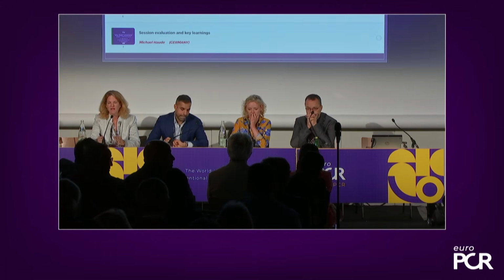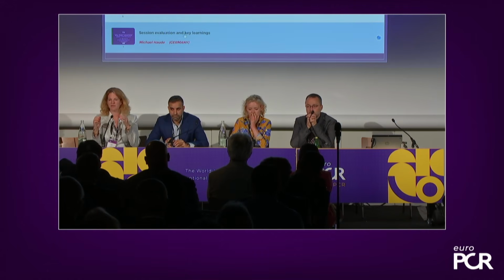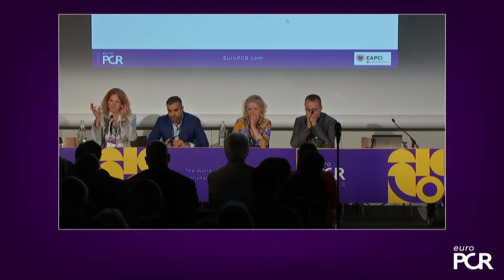Thank you very much for the good question. First of all, we are talking about self-expandable valves. We have a certain oversizing when we choose the size of the valves, and this helps us to fixate the valves. In the superior vena cava valve, you can see that there is like a crown in the upper part of the valve that will fix the valve in the confluence of the brachiocephalic, and then the belly will be in the straight part of the superior vena cava.